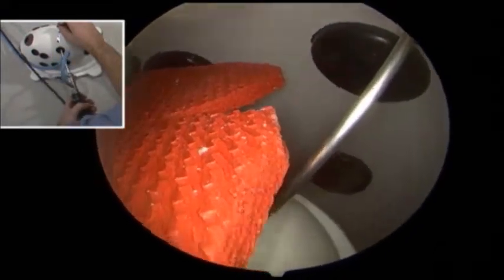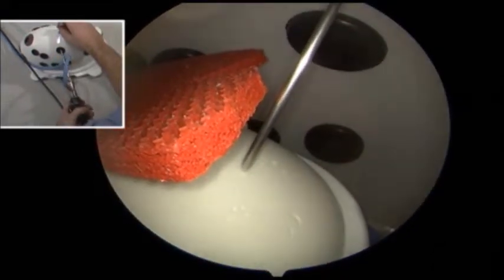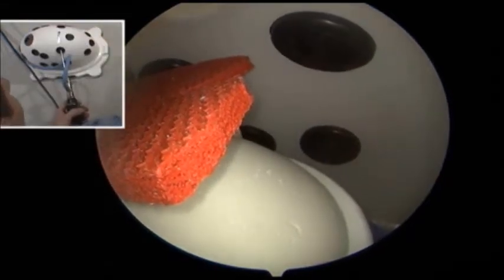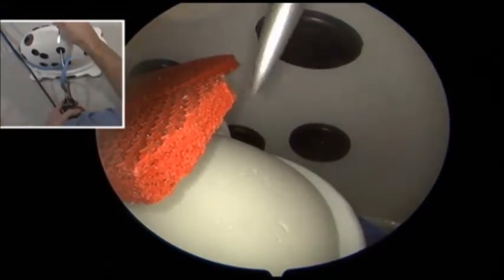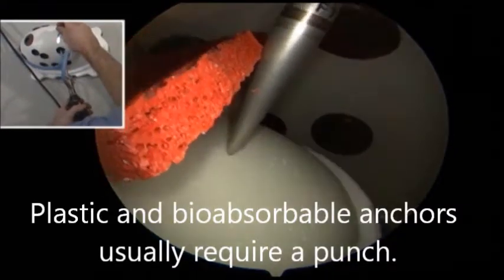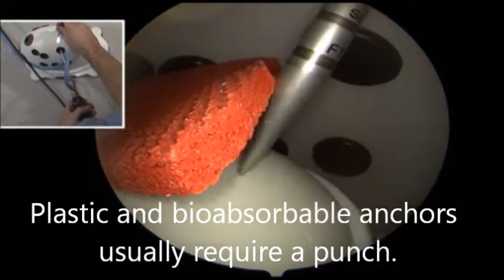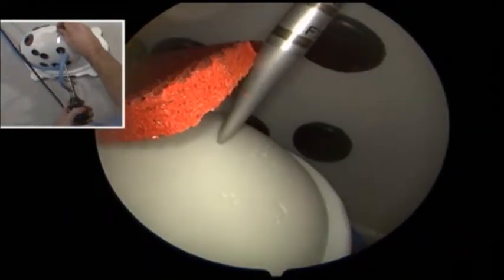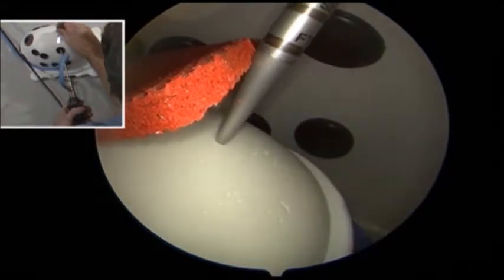Then we can look over where we are anteriorly. I think we'll move it back just a little bit here. And I like that position. Now we're going to insert our punch, and again visualize to make sure that we have the angle of approach that we like, the position on the cuff that we like. We'll have our assistant tap this home.